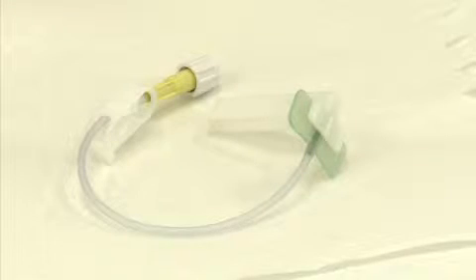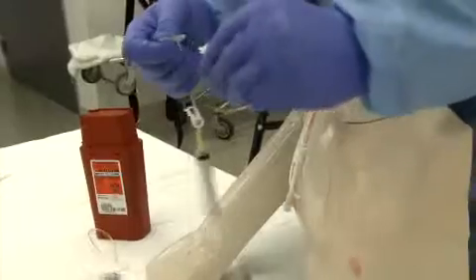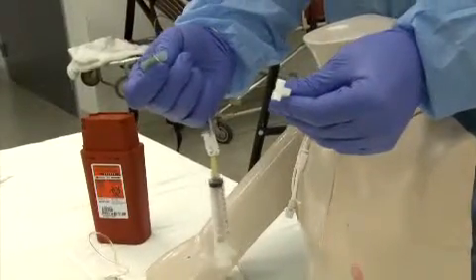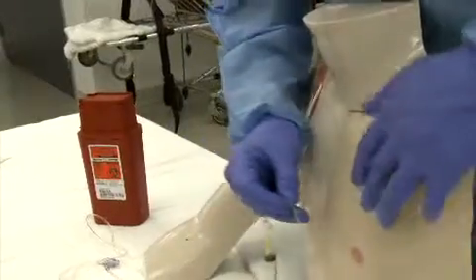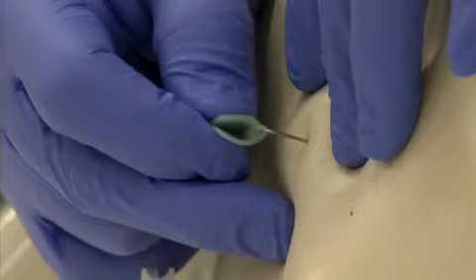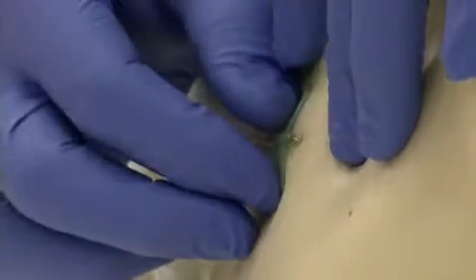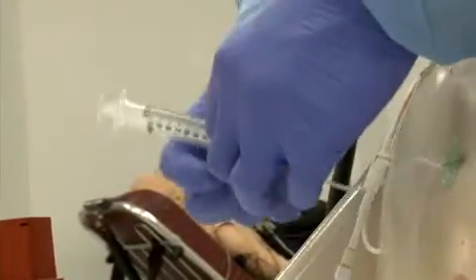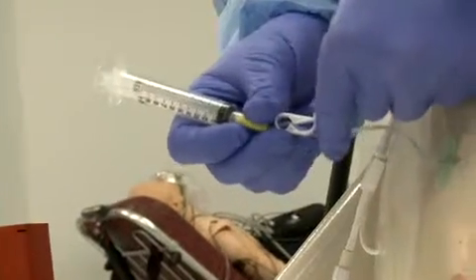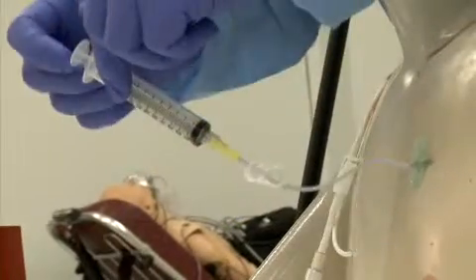In this example, we are going to access an implantable venous access port, an example of which is Portacath. This device is implanted subcutaneously and is accessed externally using a specially designed needle called a Huber needle. Unique features of this device include the 90-degree angle of the needle so it sits flush with the skin after insertion, the attached tubing, the inline clamp on the tubing, and the needle opening, which is on the side of the tip rather than on the beveled end of a standard needle.